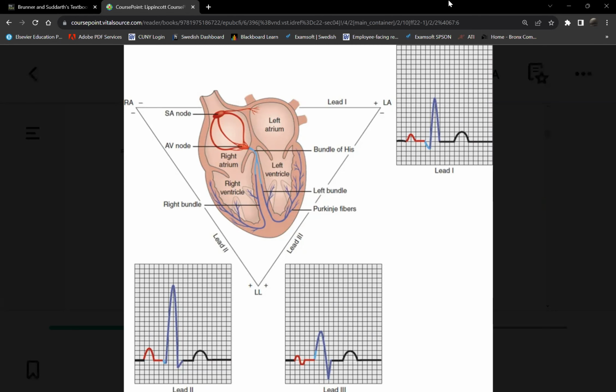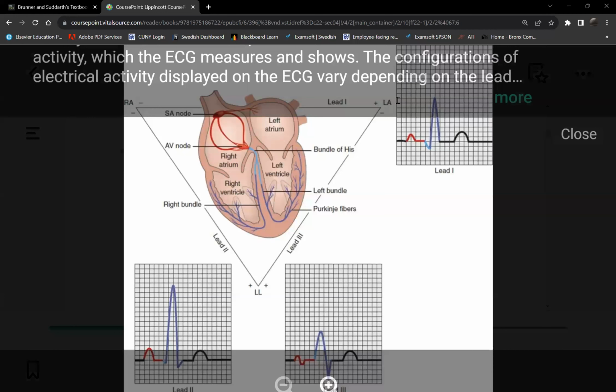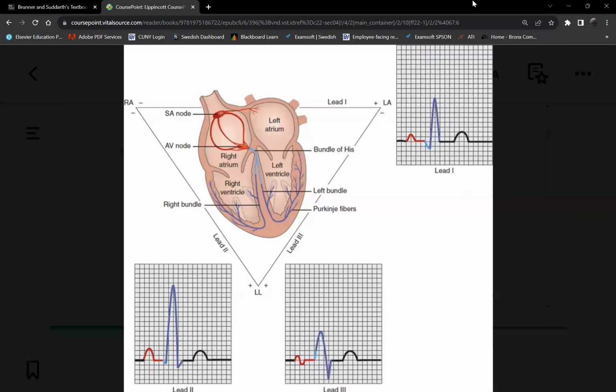I'll show you a 12-lead ECG paper reading shortly, which will give you a different view of the cardiac cycle, of the waves and complexes, depending on which view it is taken from. For instance, when we say left arm, because it's bipolar, the line of sight is actually, this is not testable. Okay, I'm just trying to explain why the view is such.